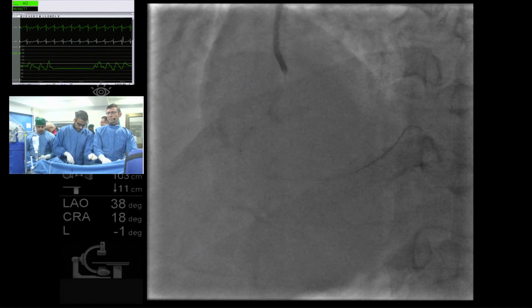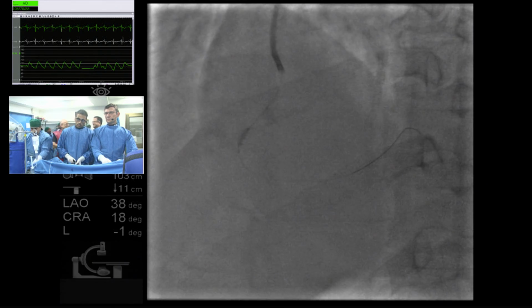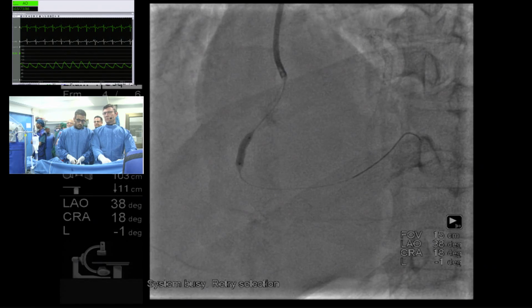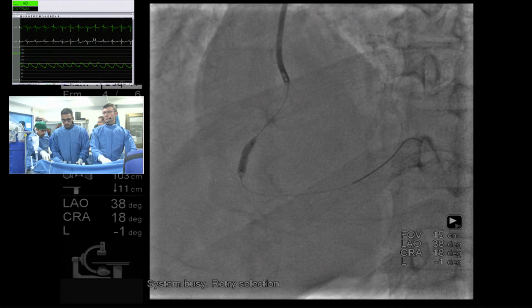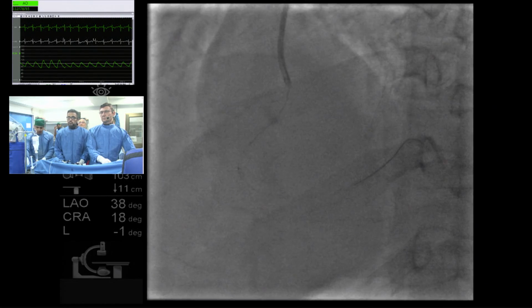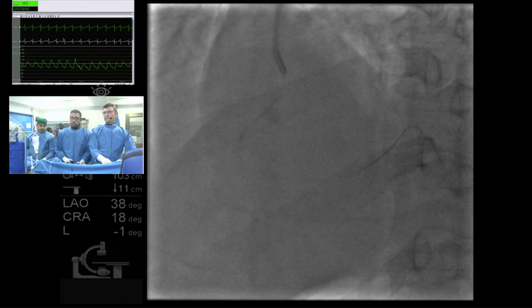It's a very important question and very difficult to answer correctly, but we have to check the vessel condition, right? The tortuosity is the problem. If it is tortuous and the beam is not perpendicular, sometimes imaging overestimates, right? So at that time, if there is a completely normal portion, I try to measure the shorter axis, right? That might be the correct one.